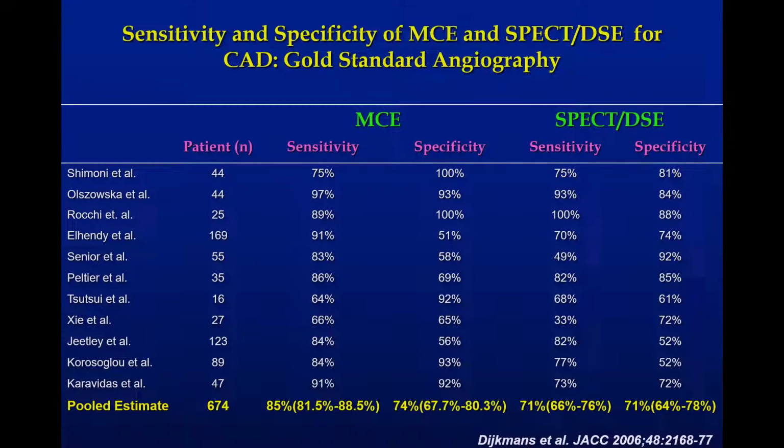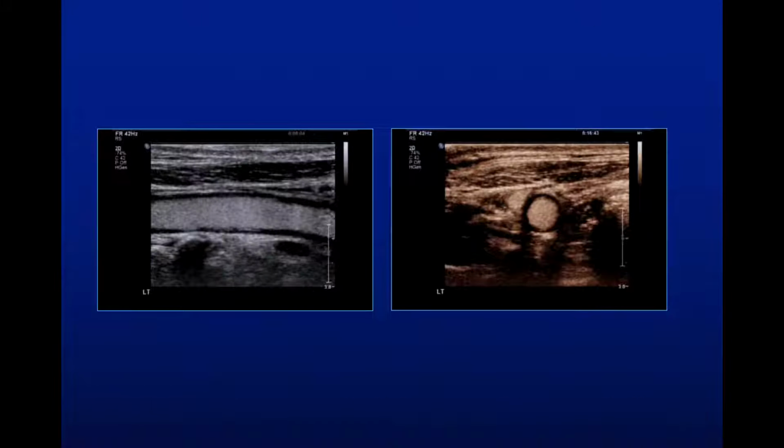So yes, you could use it from time to time during a stress echocardiogram when you have contrast. But I think most of the emphasis, at least in my book, is on wall motion and global function, and perfusion may be additional at the same time. And if we're concerned about perfusion, I think the competition nowadays is very strong. PET, SPECT, and CMR is also more robust, and less technically challenging, although there are still some issues there.